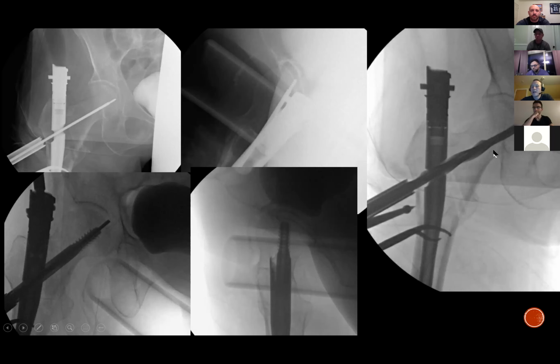So the issue becomes, how much can this shorten? Because in this fracture, if you had a sliding hip screw with the plate here on the outside of the bone, and you had a screw going up, if this calcar cortex does not encounter the medial cortex of the femoral shaft, then it's just going to keep shortening and keep shortening and keep shortening.